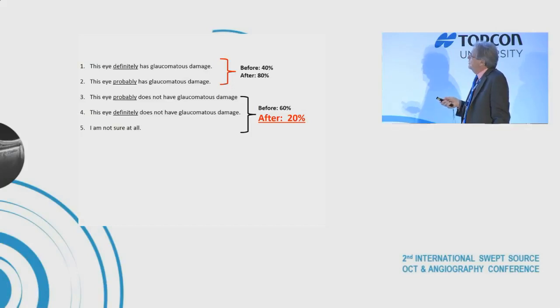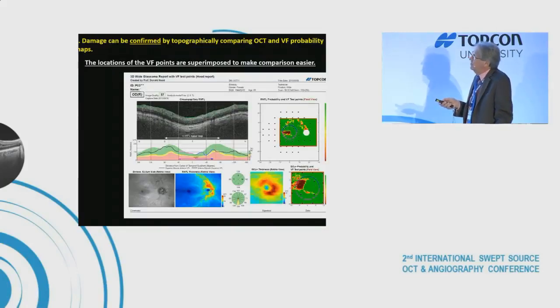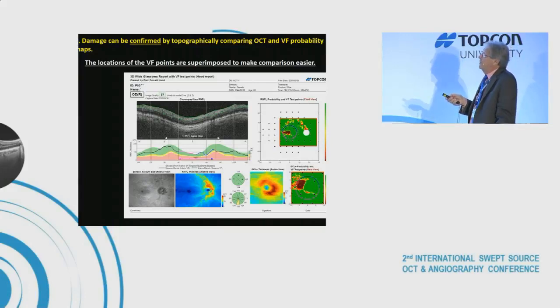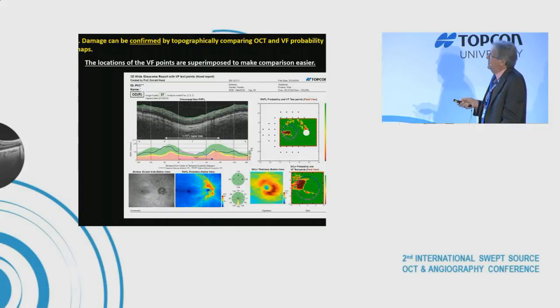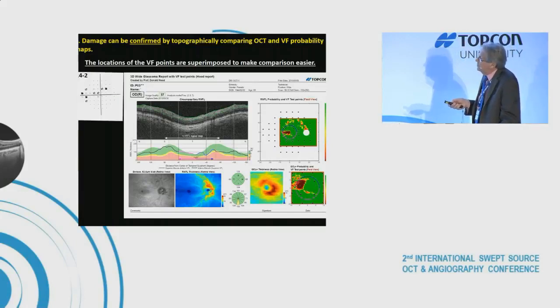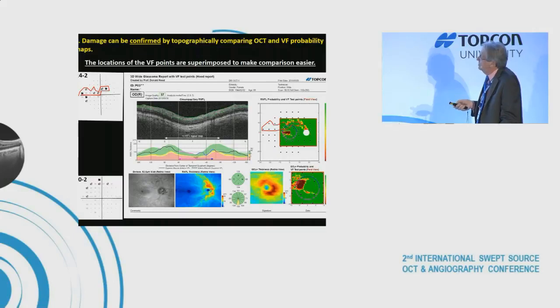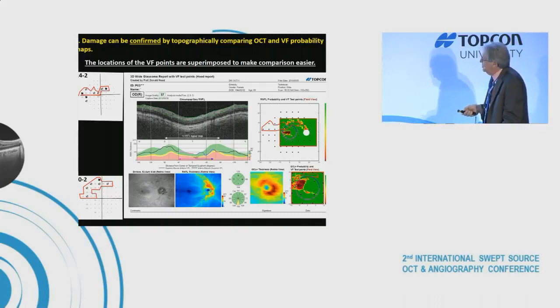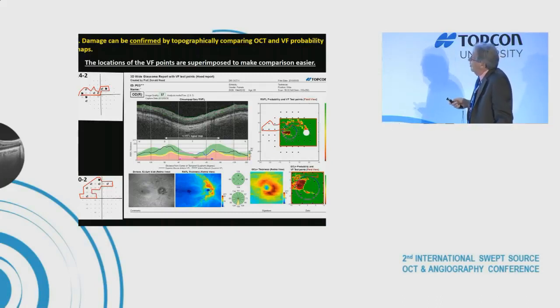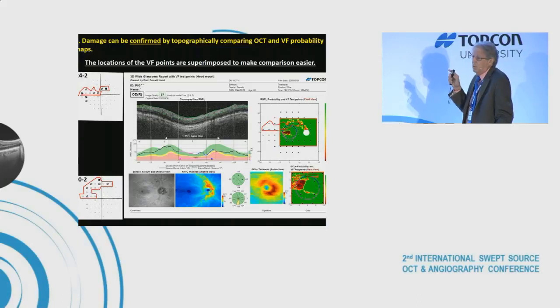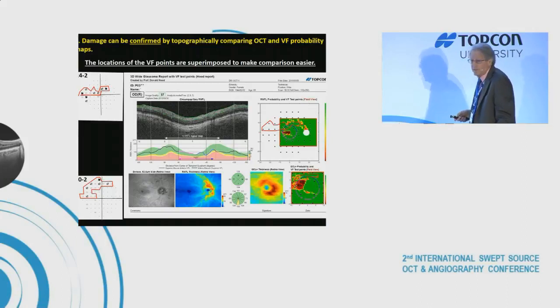The last principle: you can confirm damage by topographically comparing OCT with visual field probability maps. Here's the 24-2 — abnormal regions in the upper visual field appear to match. For the 10-2, circling those points corresponds to specific locations on the map. On this map, large points are the physical locations of 24-2 test points and small points are the 10-2 locations.